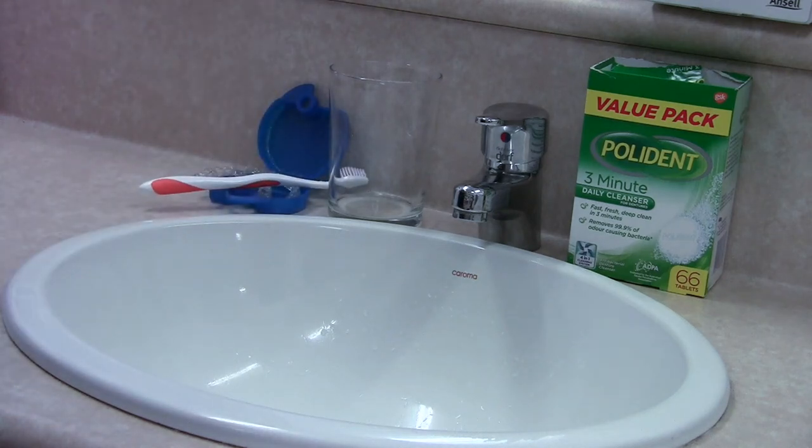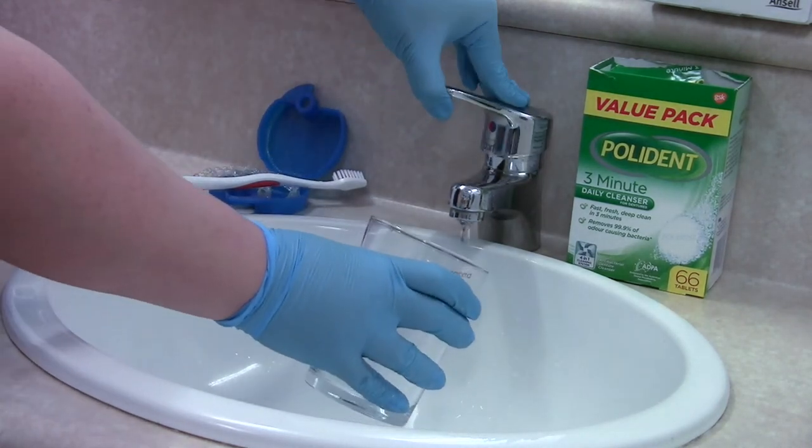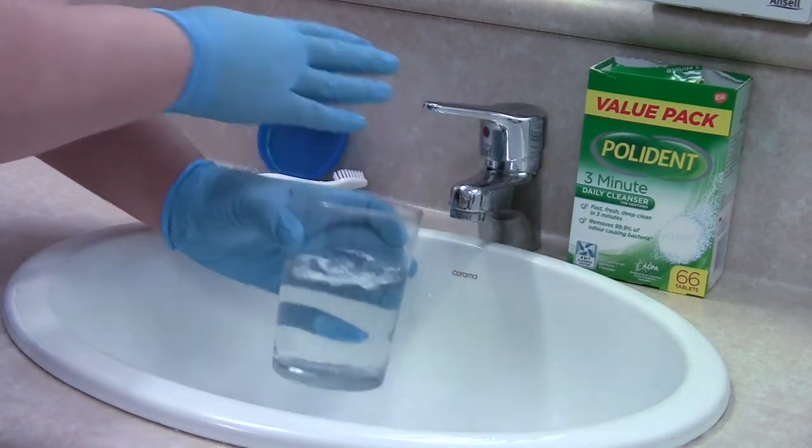Over time, you'll notice your aligners may be stained or have an odour. What you can do is grab your glass and fill it up with warm water, then pop a Polident tablet into the water to dissolve.